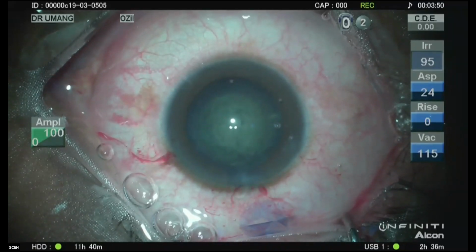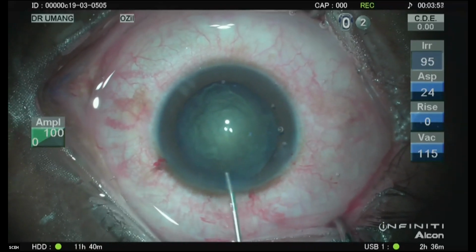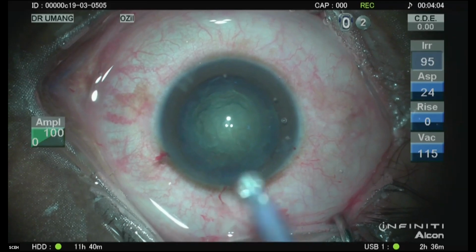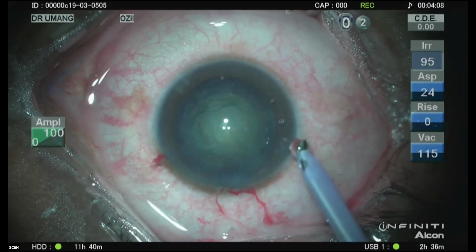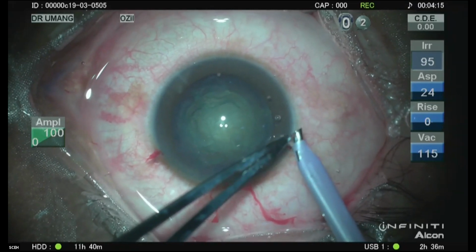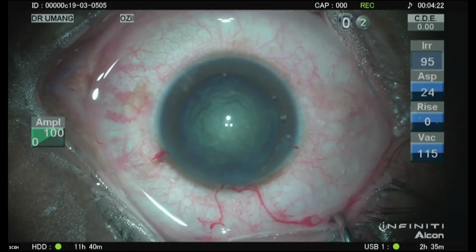So as we were discussing, before you take the probe in, it's good to deepen the chambers, because sudden change, fluctuation in anterior chamber causes pain. Now, before you go in, always inspect the tip. Here, as you see, the tip is a little more exposed than what I would like, and the irrigating port is not on the side. And so it's important to adjust that.